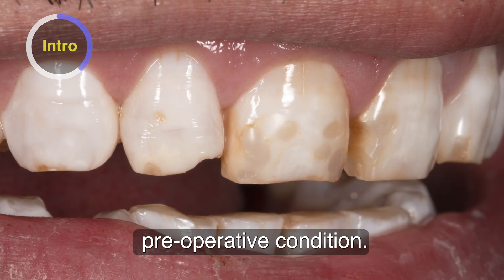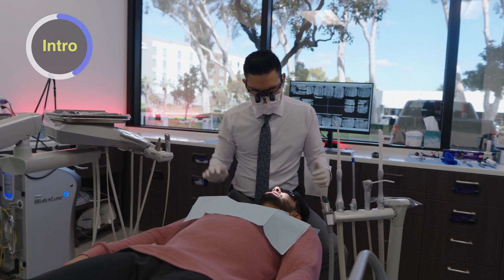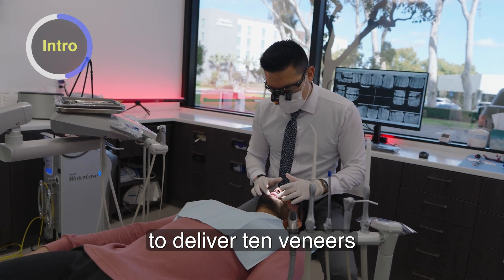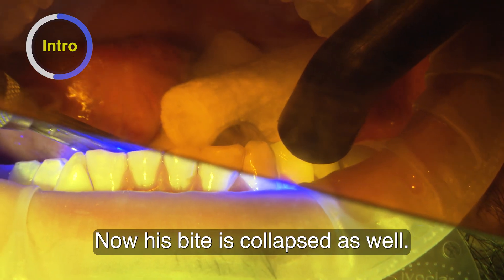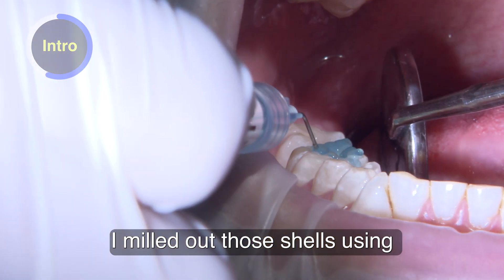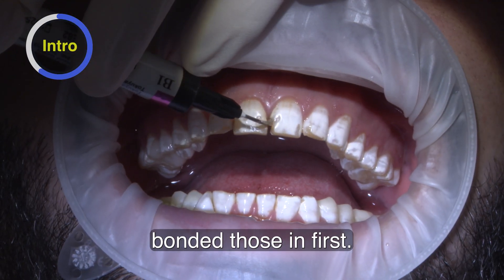You can see his preoperative condition. The plan for him is to deliver 10 veneers all in the same day. His bite is collapsed as well. So what we do is mill out those shells using biotemp bridges, and we went ahead and bonded those in first.